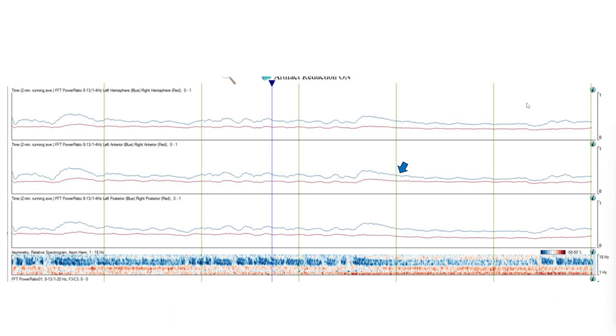The trend has been most studied for its utility in monitoring for diffuse cerebral ischemia in the setting of subarachnoid hemorrhage. As the ischemia develops, there is a relative drop in the alpha frequencies and relative increase in delta activity. This leads to a drop in ADR. In order to minimize the effect of state, post-stimulation ADRs are obtained by periodically stimulating the patients.